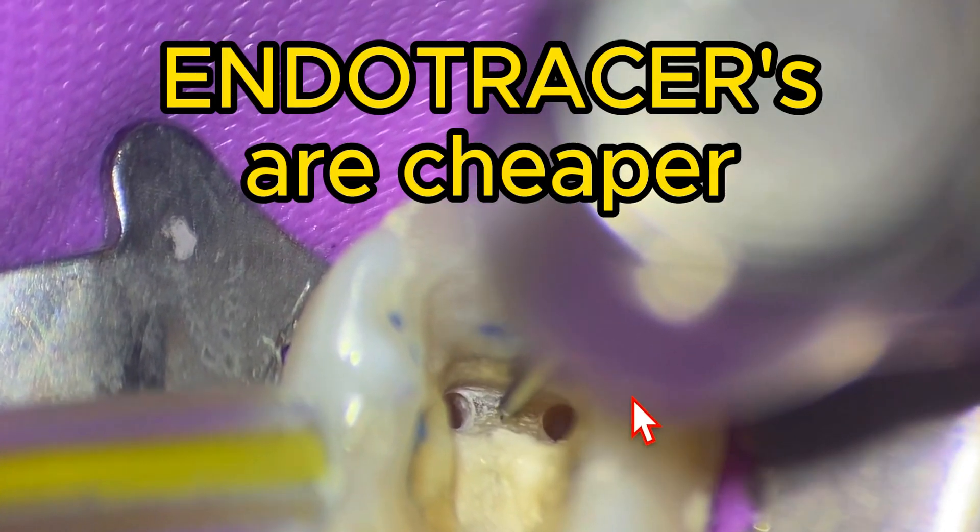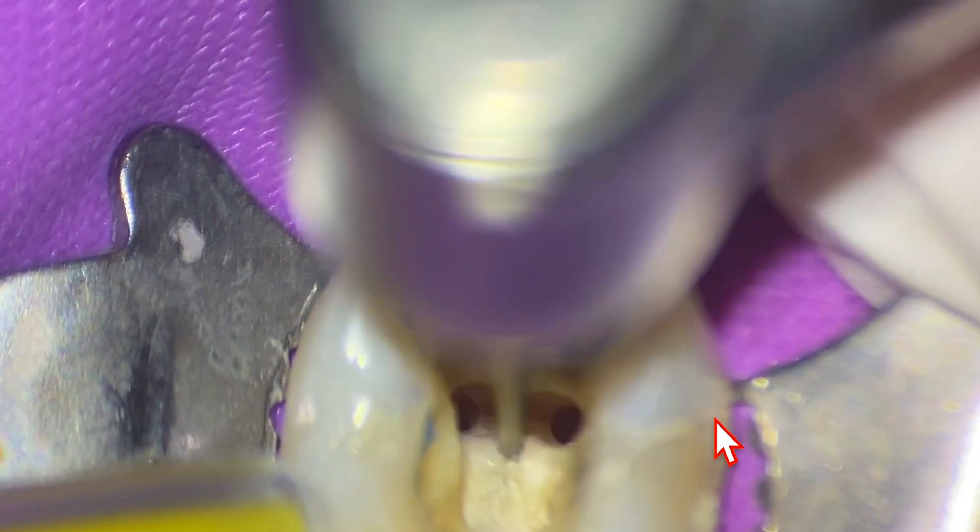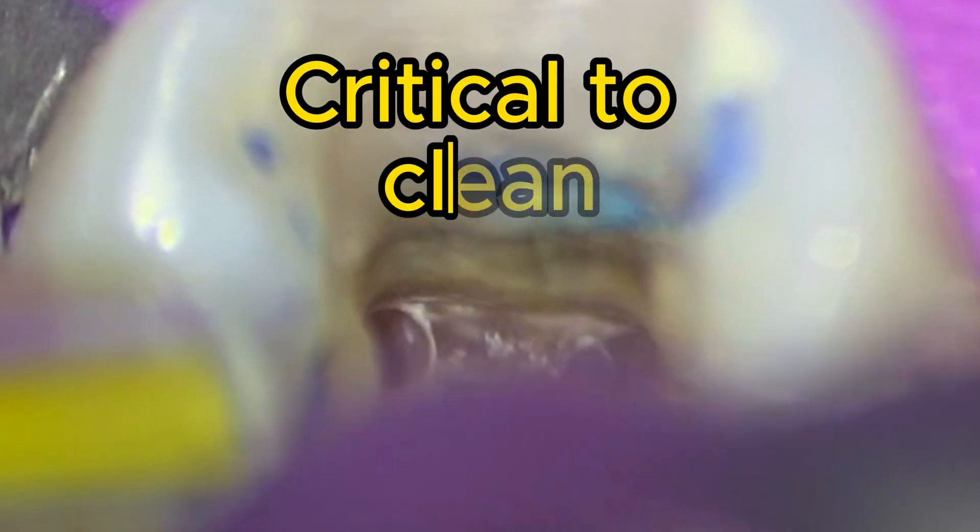The key with using a munspur — and we're going to show the difference here — is that you just have to angle the head of the handpiece out of the way. Whether you use a munspur, a small high-speed bur, slow speed in your electric handpiece, whatever kind of bur — it's critical to clean this out because we're looking for any little clues to see if there's a middle mesial canal.